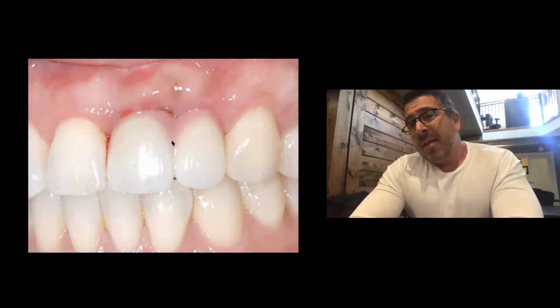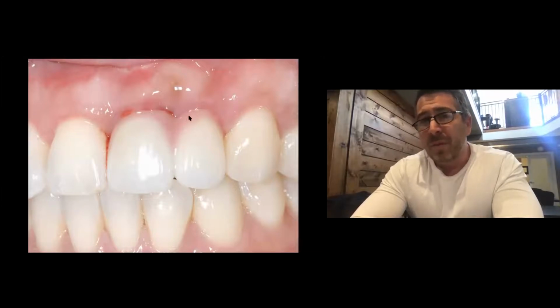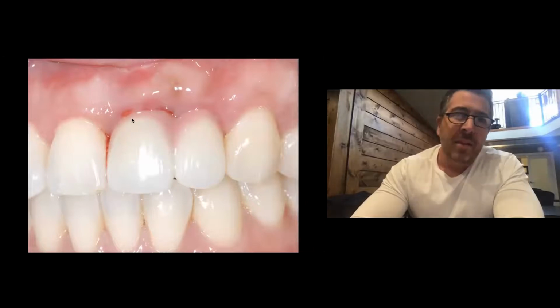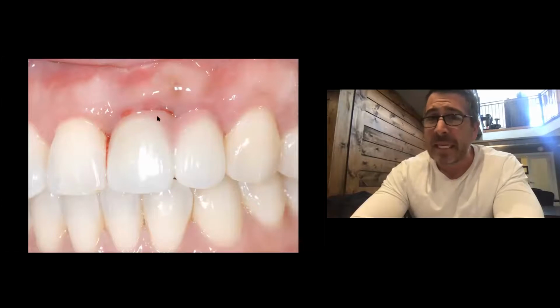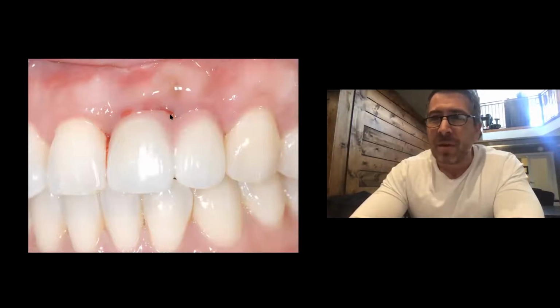So now I think this actually turned out fairly nice. I think if the lab spends some more time on the case with the pink, we can get a nicer result. But in general, I think this actually turned out fairly decent. She comes from a distance, so this was the day we put this in. A small detail, and again, the more of these things people do, and people that are experienced implant dentists on here may start to pick up on some subtle things.